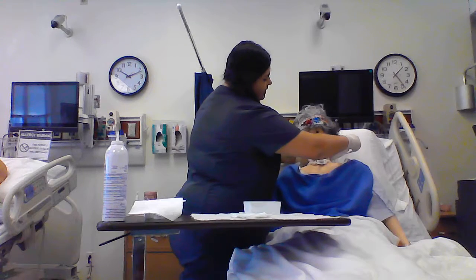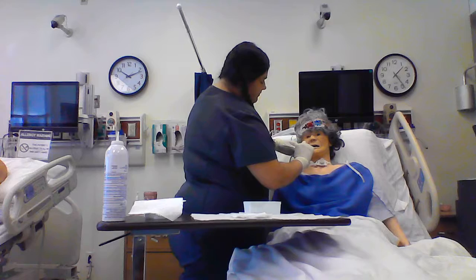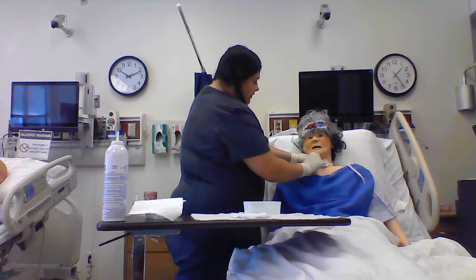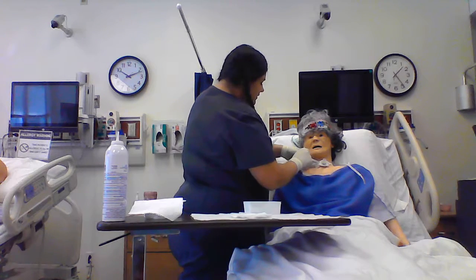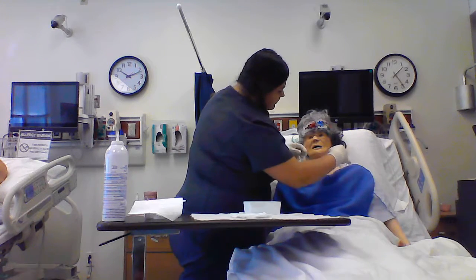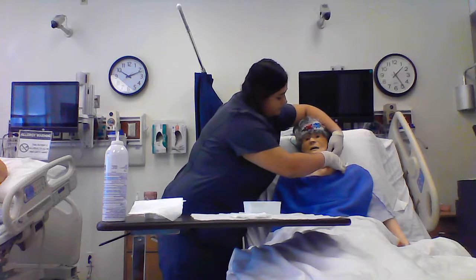I'm going to make sure that I put my new trach ties on while the old trach ties are on. That way my cannula doesn't come out or anything crazy happens. Sorry, I'm reaching over you here, Miss Opal.